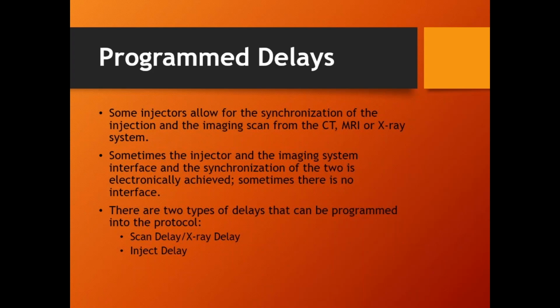The wire goes into that one, and specifically for the MedRad injectors, there's a wire that comes out of the control box, and it's called ISI, Imaging System Interface. It's the ISI port, and it'll go to a little box, and the box is literally this big, and it's white. And there's 3 different boxes.